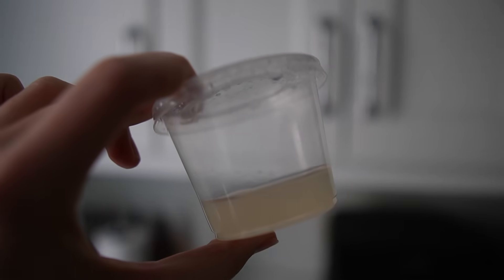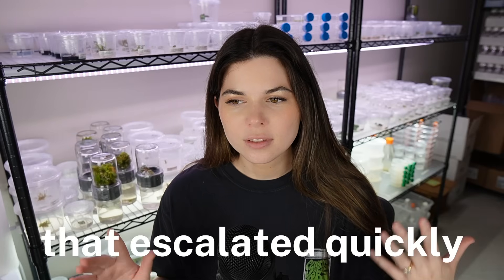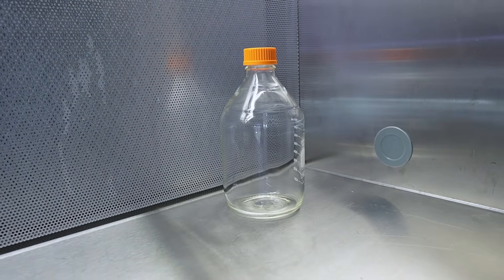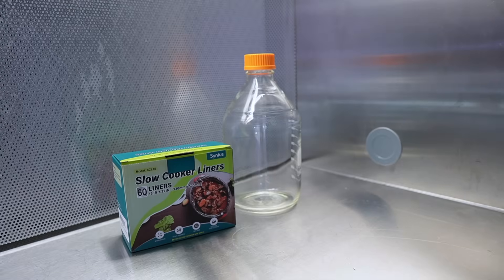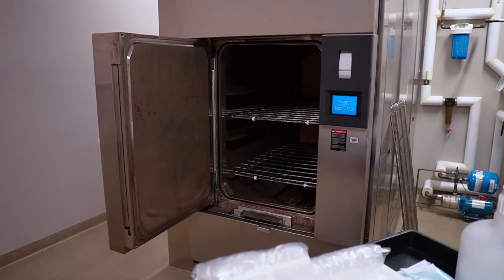That is it for the no-pour method — the method I used for a very long time until I moved into a new laboratory space with access to a larger autoclave. The next method I'm going to show you is a lot more efficient if you're making large quantities — think 3, 4, 5, 10, or 20 liters at once — but it does require a laminar flow hood. In addition to the flow hood, you also need a media bottle or a few, slow cooker bags, containers, autoclave tape, and either a large pressure cooker or an actual autoclave, which is what I'll be using today.